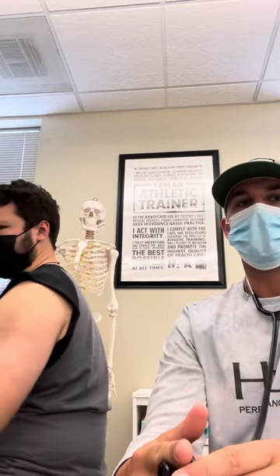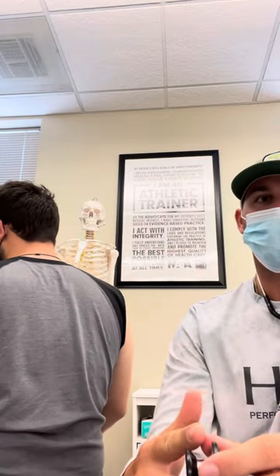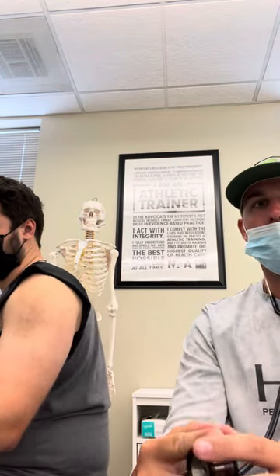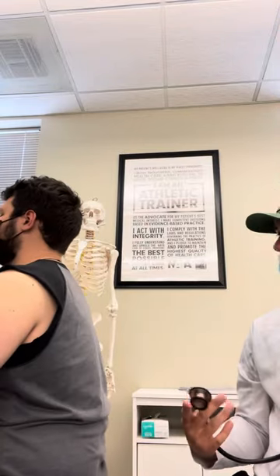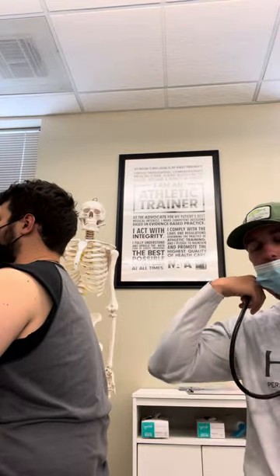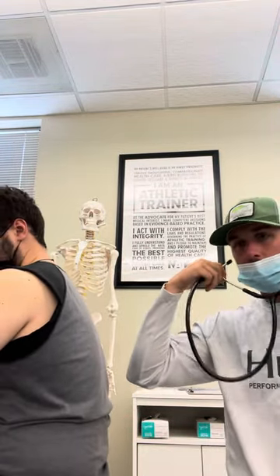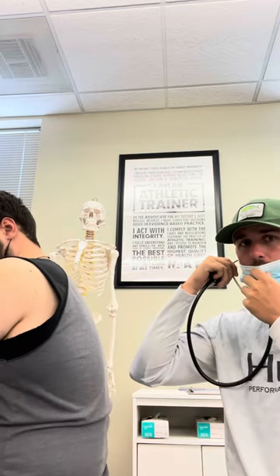Hey guys, Andrew here with John. In this video I'm going to demonstrate how to use a stethoscope for our auscultatory points on the anterior, posterior, and axillary sides of the chest. So first off I'm going to put my stethoscope on, and I'll start with the posterior side.